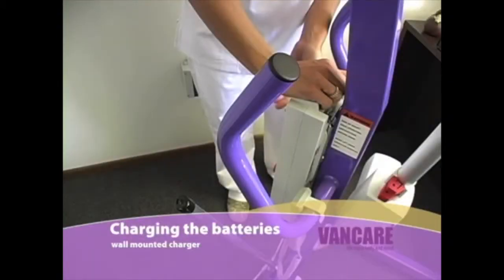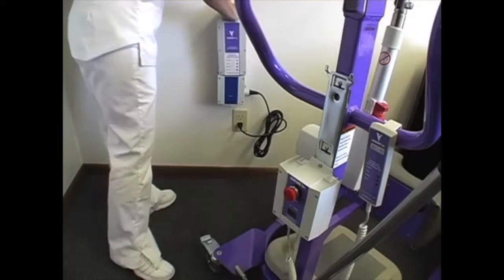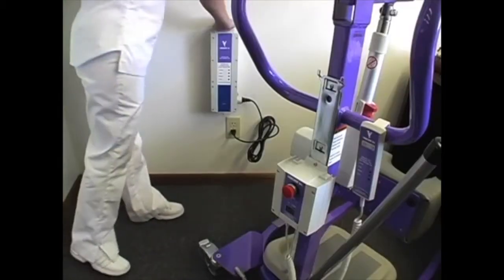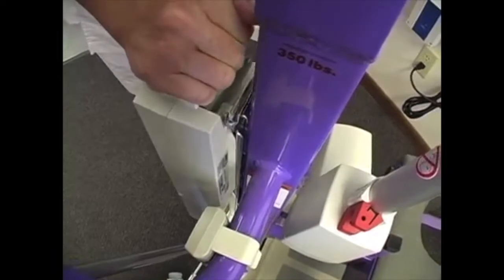Charging the batteries with a wall mounted charger. Remove the battery pack from the lift and place it on the wall mounted charger. The yellow LED charge light and green LED on light will come on indicating the lift is charging. When the battery pack is fully charged, the yellow LED light will turn off. Remove the charged battery from the wall charger and place it back on the lift. For more information on battery charging refer to the operating manual.